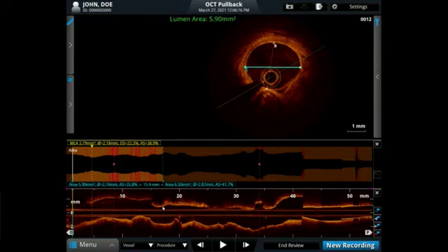In this situation, I think we can really be tempted to then go to perfect the result with a high pressure balloon. I would really warn against it, and that's where I've run into problems having used Shockwave. There has been no perforation, and then with the stent implantation, no perforation. But when you go then with a high pressure balloon and there's nodular calcium, you push it through the wall. I agree totally with you. If you've changed the compliance here, you can inflate a stent with full expansion at nominal pressure, and I think you'll get a very satisfactory result.